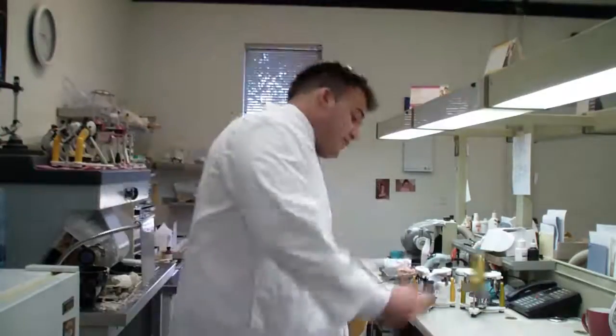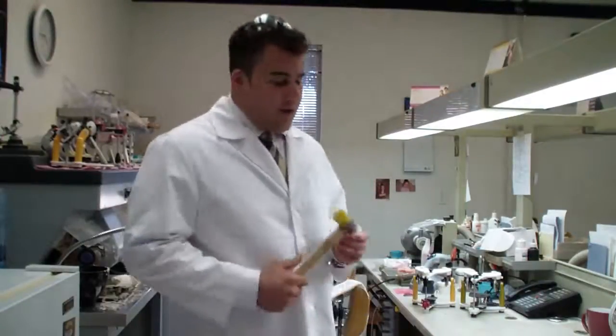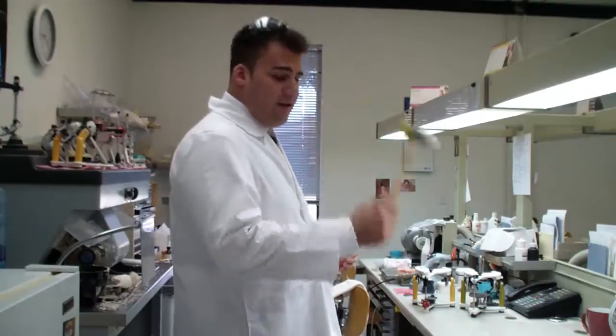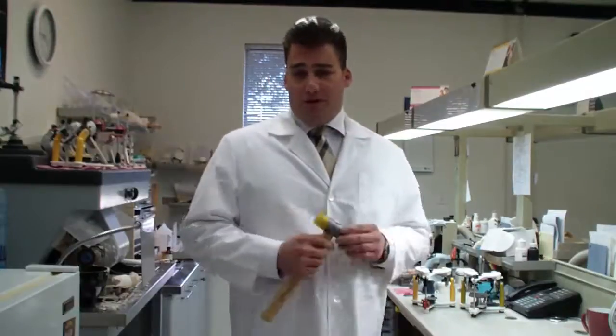The way we're going to make this as scientific as possible is I'm not actually going to take this hammer and start whacking away at the dentures. What we're actually going to do is hold the hammer like this and let gravity take its place. That way I'll find it to be as relevant as possible.